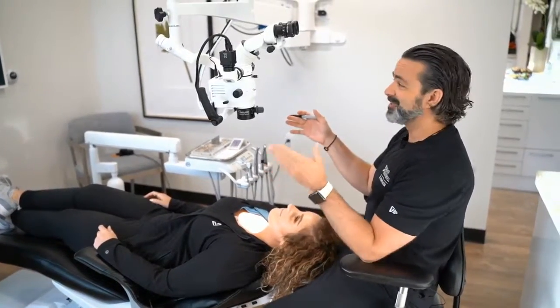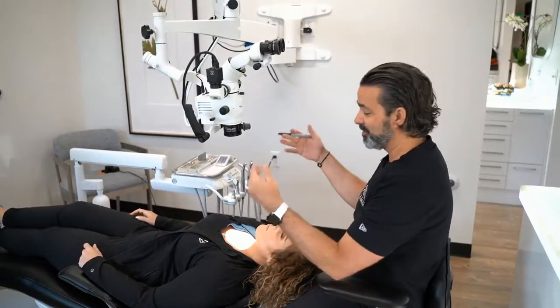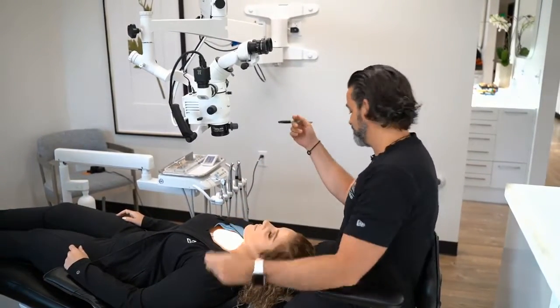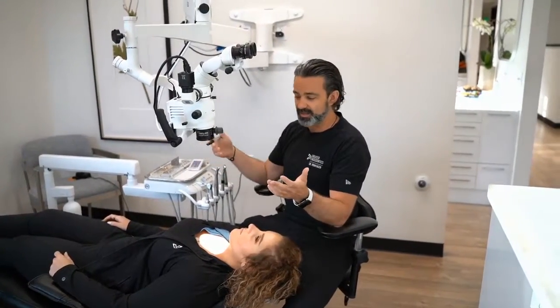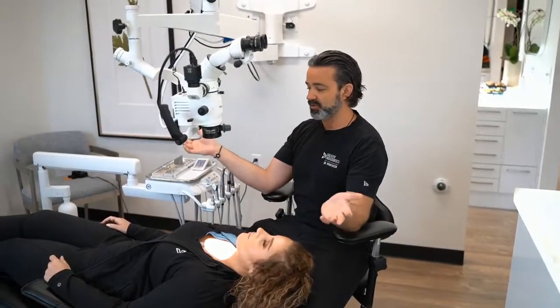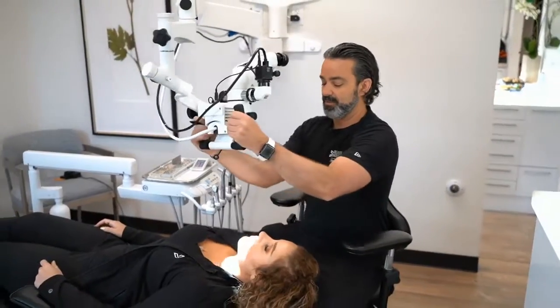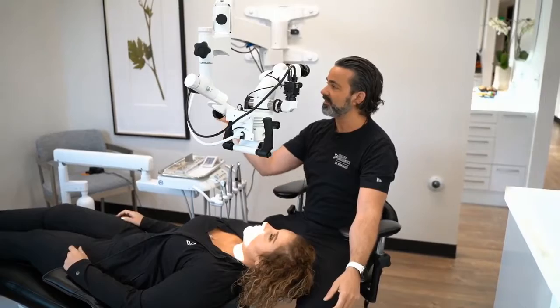The one thing is when you're worrying about focus and working in the mouth, working in the 12 o'clock position is phenomenal. It's awesome. Now, I know a lot of guys will come in this way, and that might be the way you were taught in dental school, and you might have practiced your whole career right here if you're a right-handed provider, and that's fine. And what it does is it kind of puts the microscope like this. If you want to see, I've got her up on the screen.